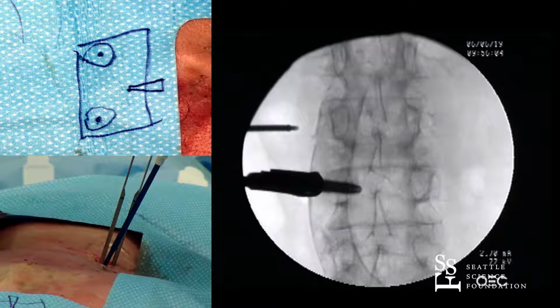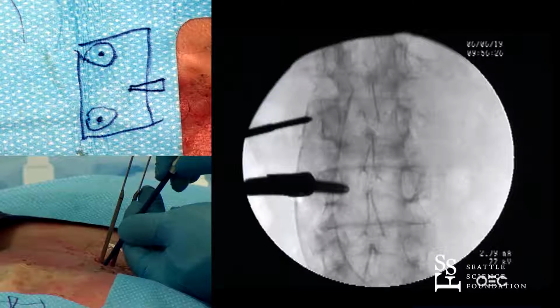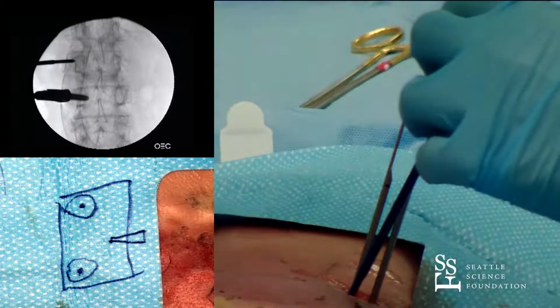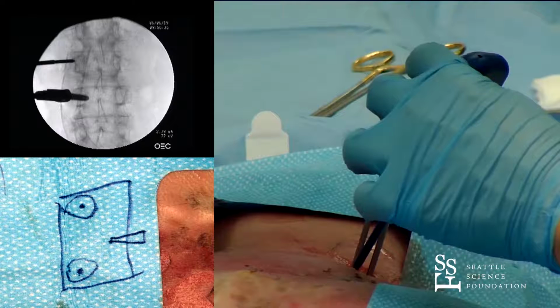Okay, shot. Same thing, I'm going to go right into the center of that circle. Well, I want to end up there, mallet. Shot. And the only trick is you have to be a little bit aware of where you're going.